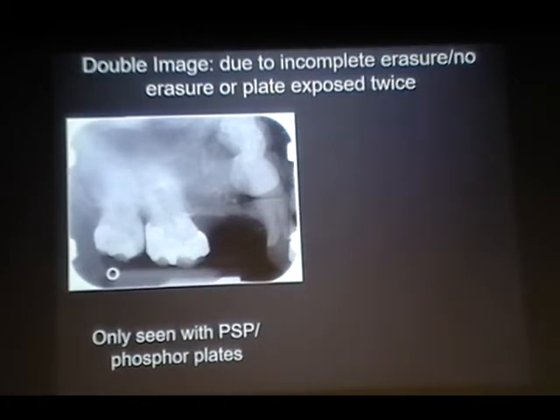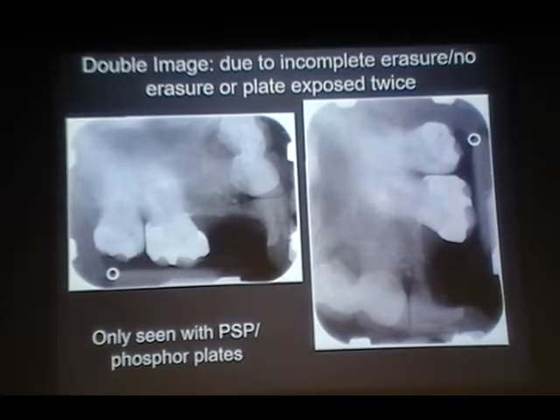So again, remember, this you're not going to see in our clinic or in the school, general school. This you are going to encounter only if you are using phosphor plates or also called PSP plates. So it's pretty much similar to film. If you have attended any dental practice, you may have seen.